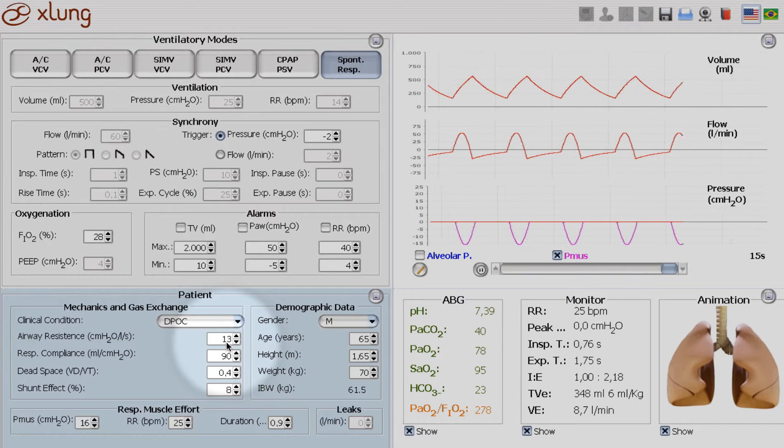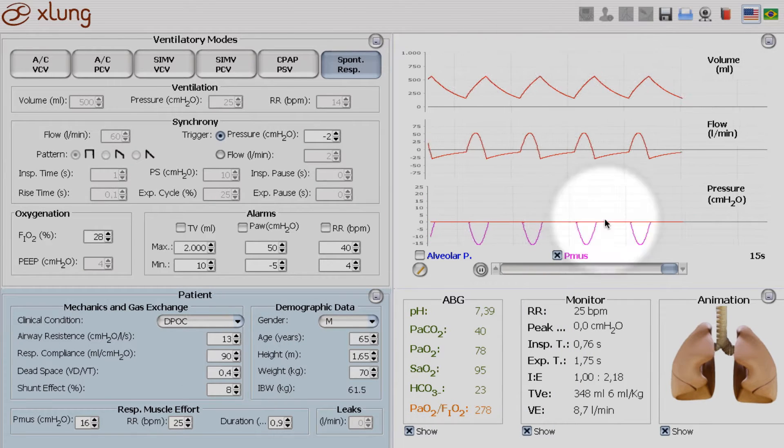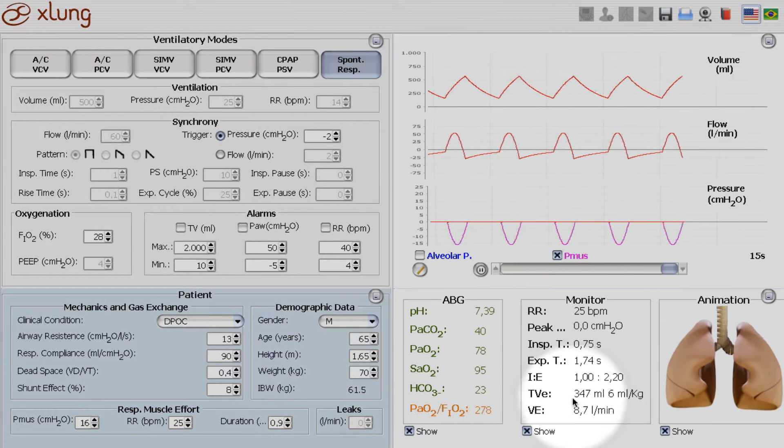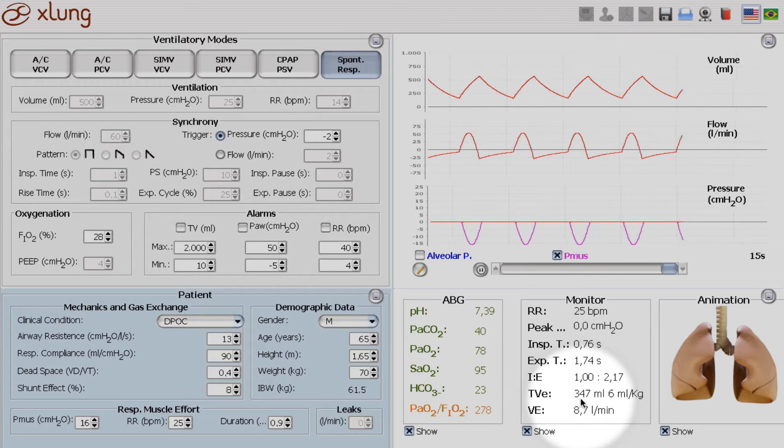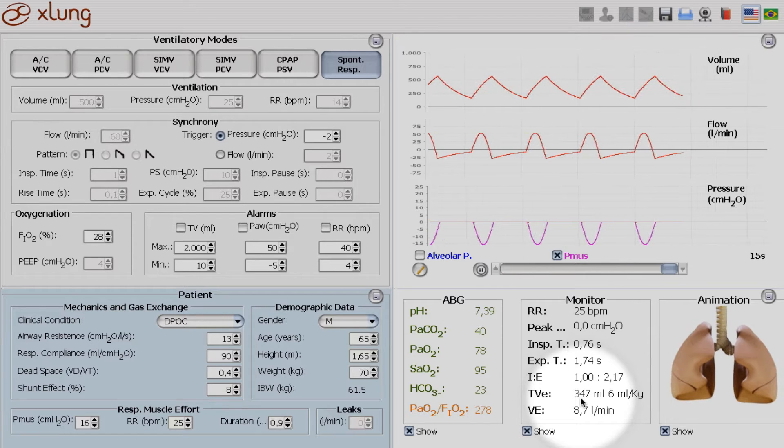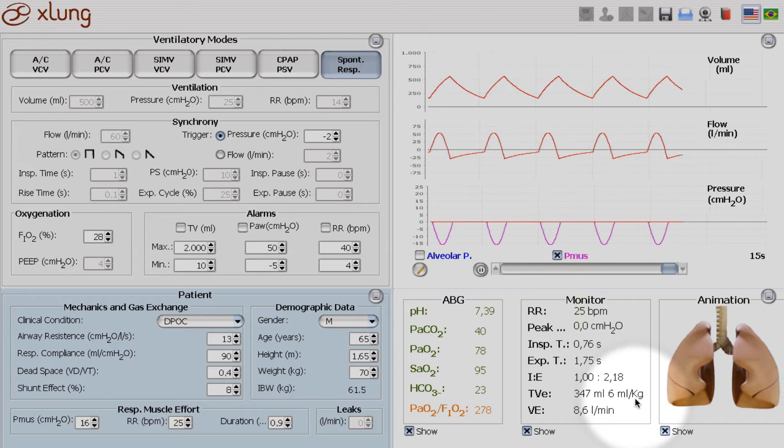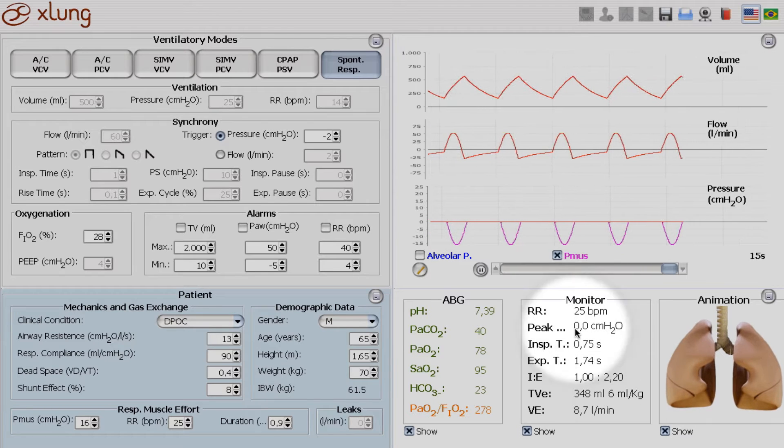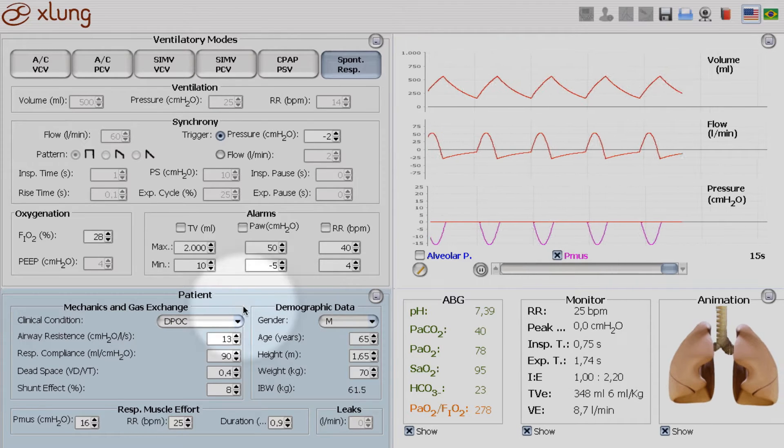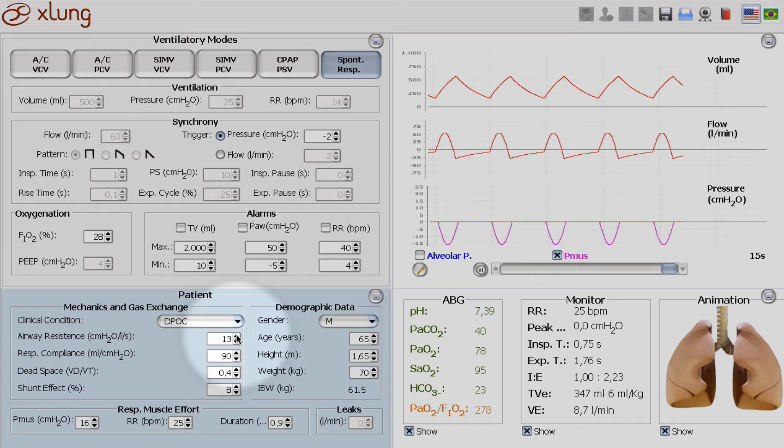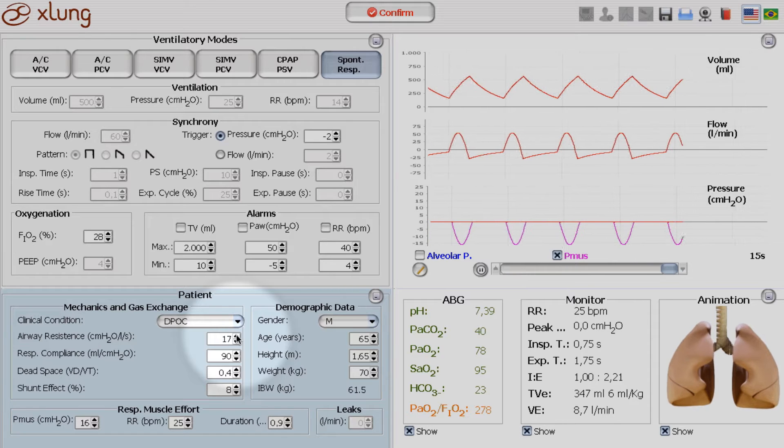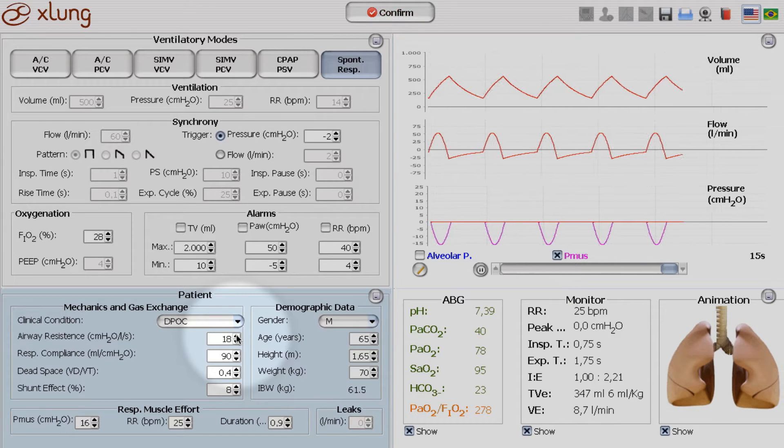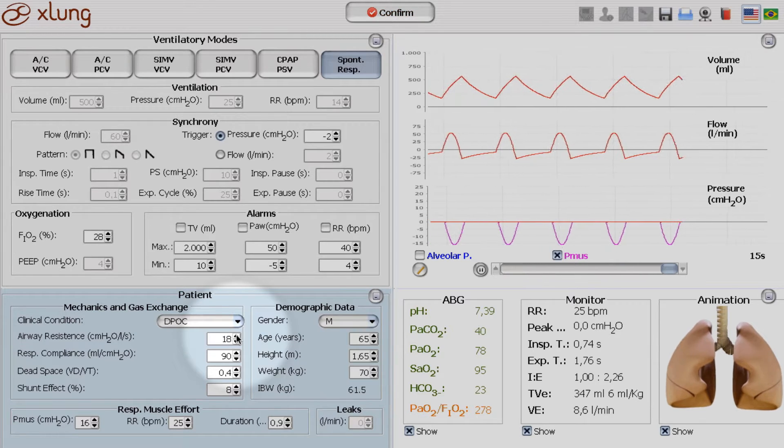Please look at the tidal volume. It is now around 350 ml, 6 ml per kilo, with a respiratory rate of 25. And we will increase the airway resistance to 18 cm of water per liter per second.